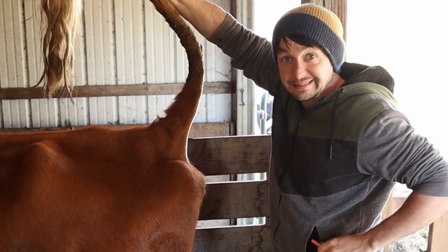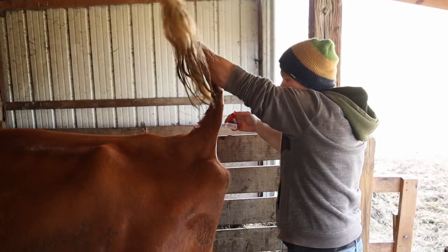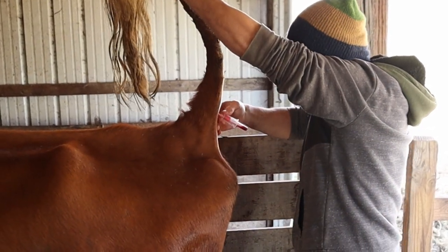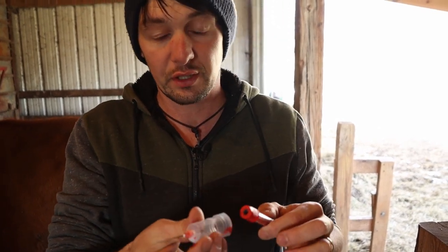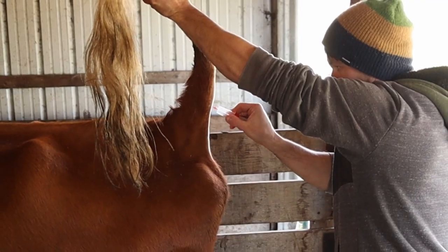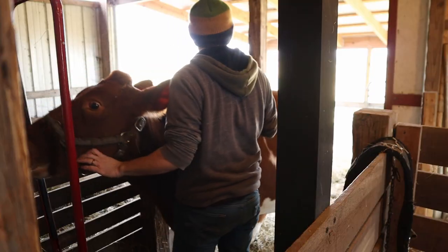We're going to hold it like this, stick the needle in at a 90-degree angle right up the center of the tail — there's blood. If I go in too far it might stop, so bring it out just a little bit. That first attempt failed — not enough blood. When I shoved the tube on it pushed the needle too far past the vein. Going to try again. There we go — it's filling up. That is honestly one of my least favorite things to do with the cow.